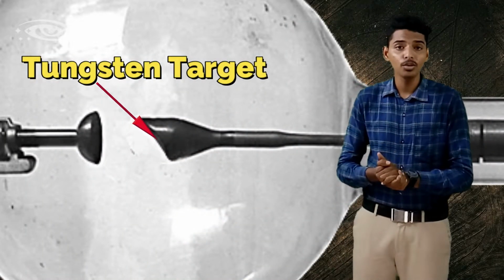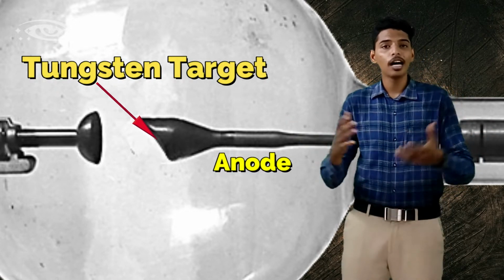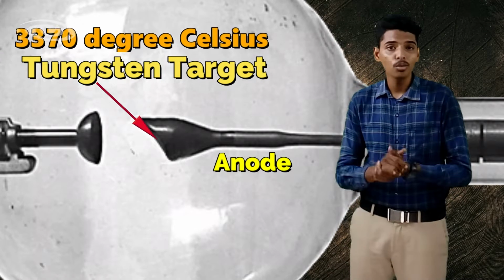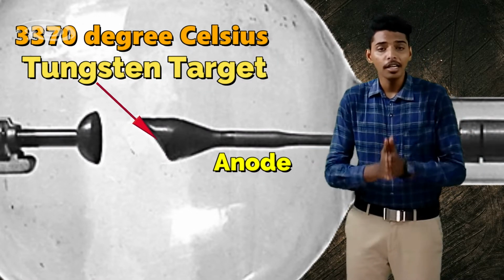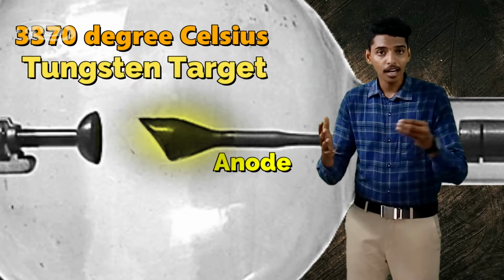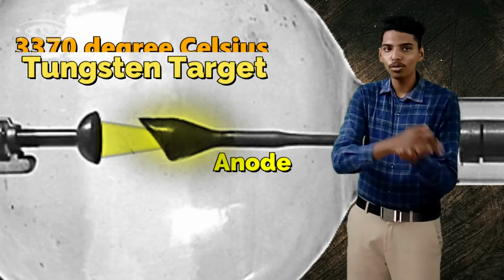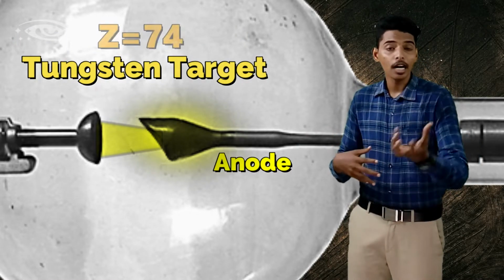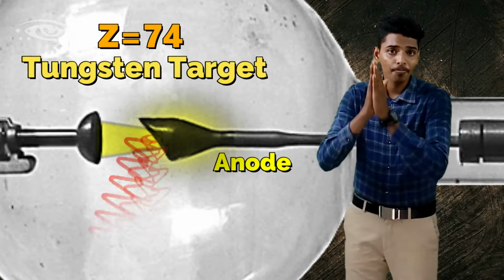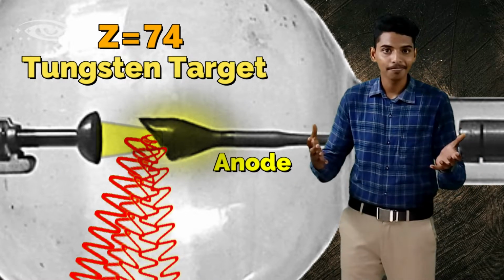And here tungsten is used as the target in the anode. The reason for using tungsten is that due to its high melting point, that is 3370 degrees Celsius, it can withstand an enormous amount of heat due to the interactions of the high velocity electrons with the target. Because of this reason we are using tungsten, and due to its high atomic number we can produce efficient X-rays and the intensity of the X-rays is going to be high.